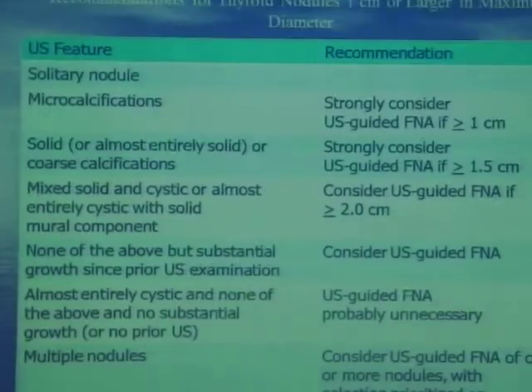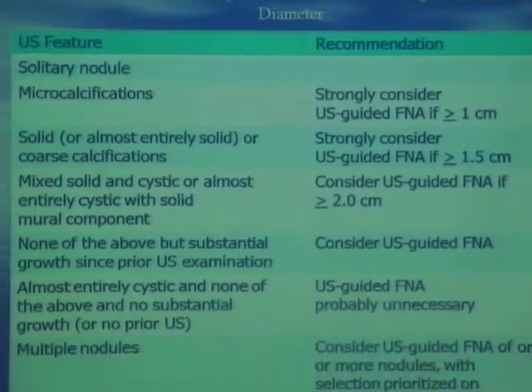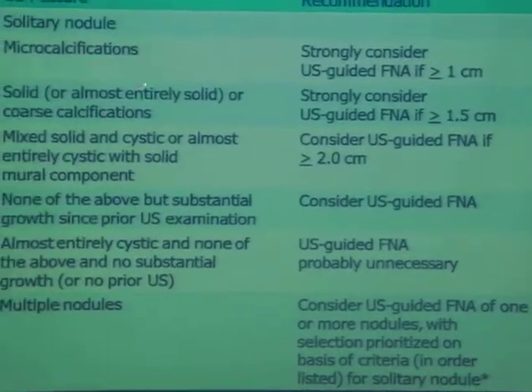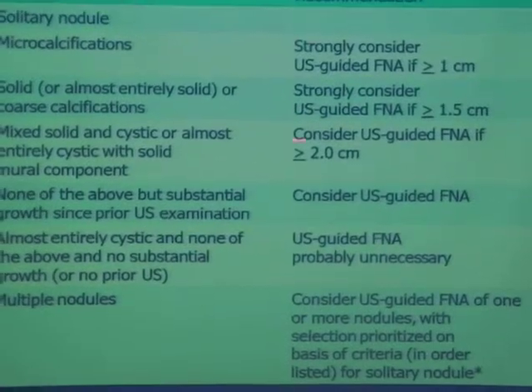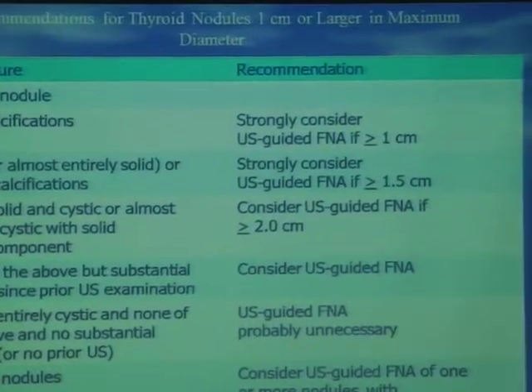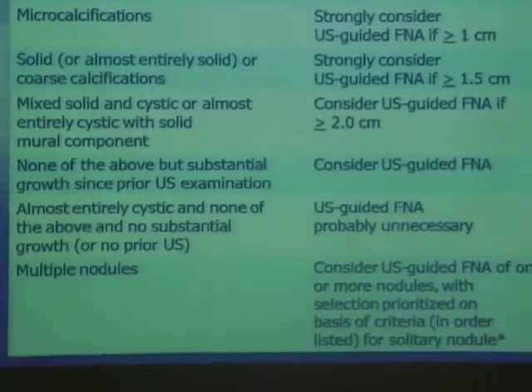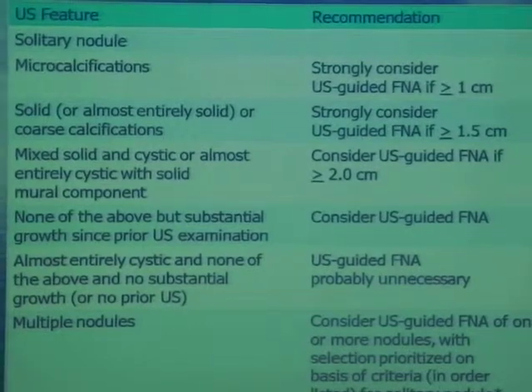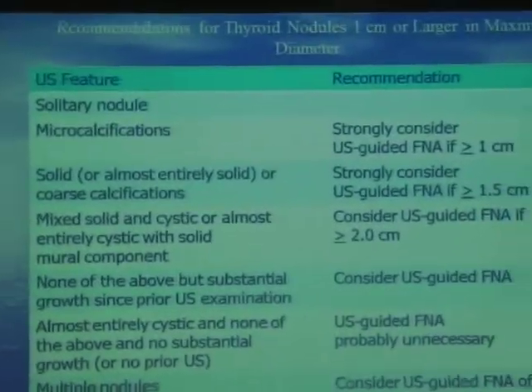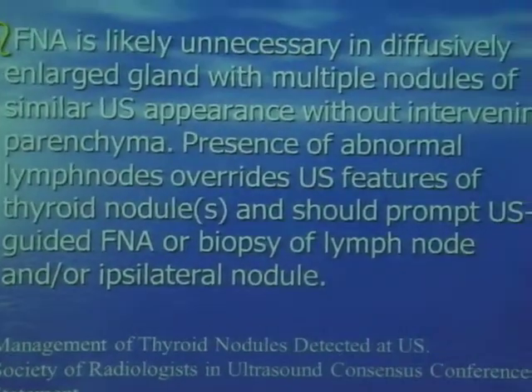Same thing here, the recommendation as to what you would FNA and what you wouldn't. And most of the time, if you have microcalcification, you are going to consider an FNA. I would consider an FNA even if it's smaller than 1 cm. I would think that nowadays you can catch nodules even much smaller than that. So I would say if you have microcalcification, you need to FNA your nodule. So this is something I won't read off here, but I think I'll just pass to Alex.